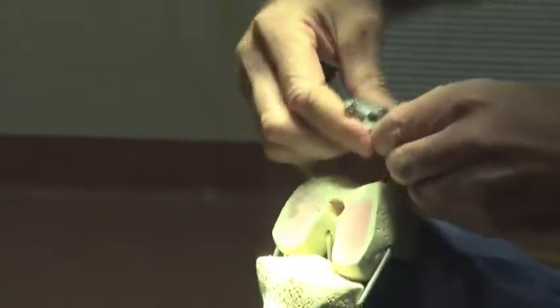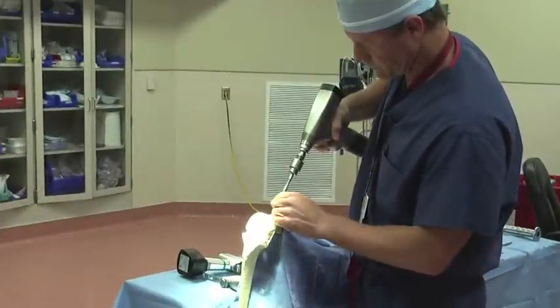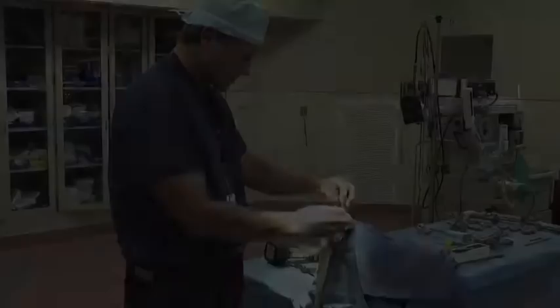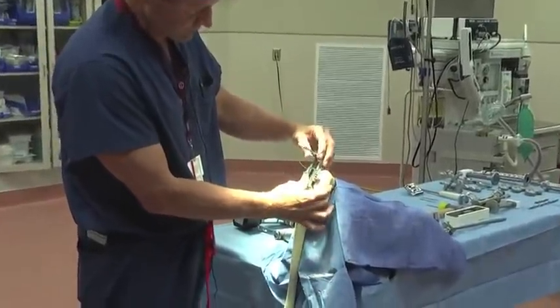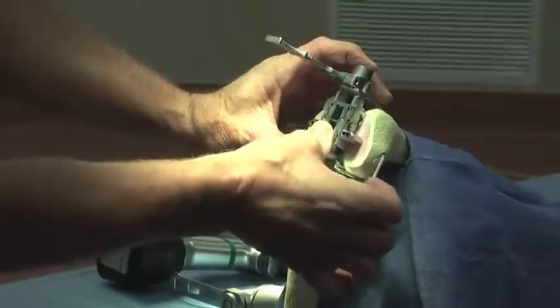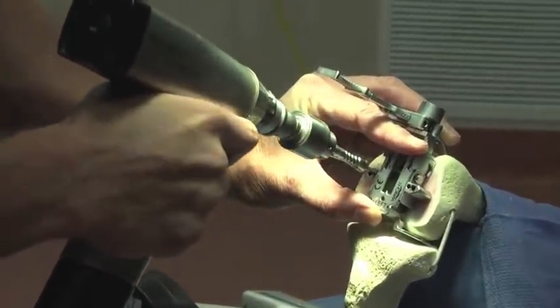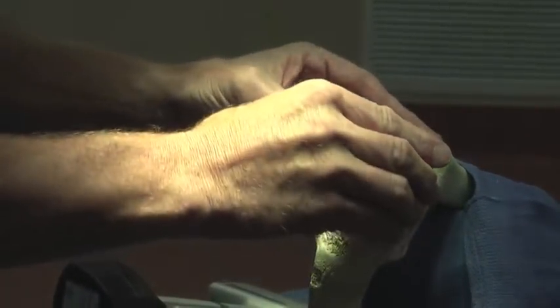Once that cut is made, where we have it nice and flat and smooth, we'll then go ahead and remove our pins. We're going to use a sizing guide to figure out what size femur we want to use. We'll put these feet down up against the underneath of the bone right here, and we'll place the block up on there and use this little stylus up on top of the bone to make our decision. We'll read it off of this area right here, put little drill pins into this guide, and then put on our cutting block next.